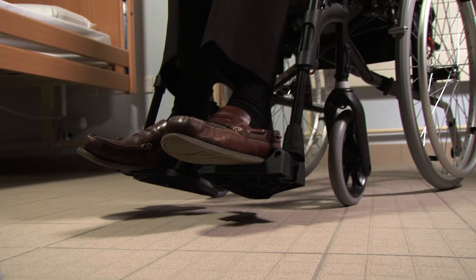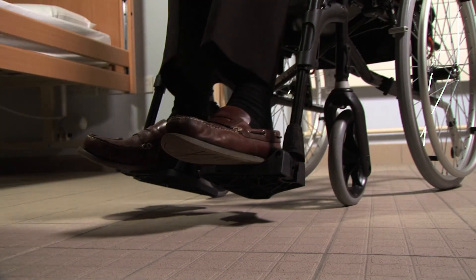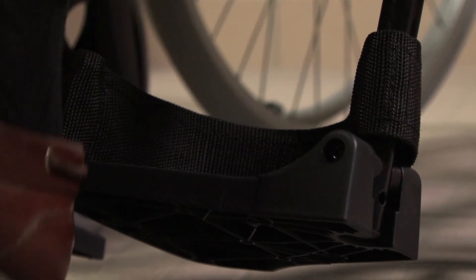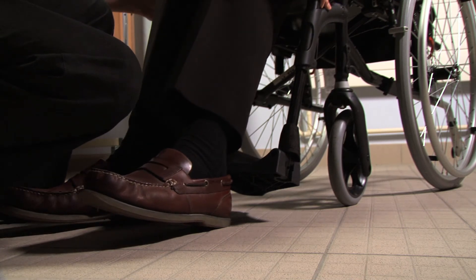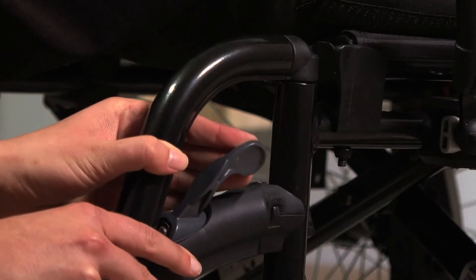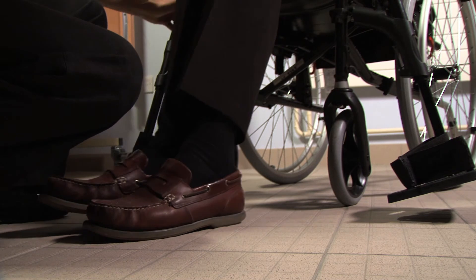The purpose of the footplates is to provide support for the feet and to avoid the feet dragging or catching in the wheelchair. When the wheelchair user is getting in and out, the footplates can be removed. To do this, the caregiver may assist by guiding the wheelchair user's feet off the footplates. They are then flipped up, the supporting clip is removed and the plates swing to the side of the chair.